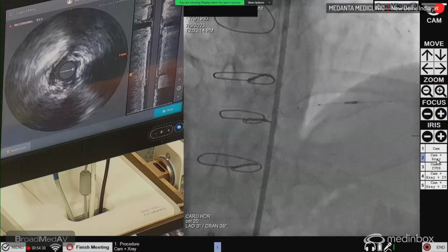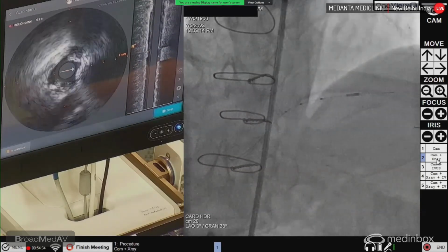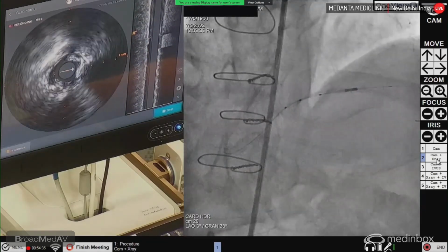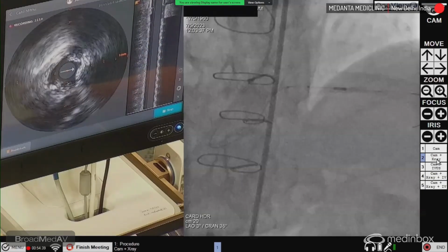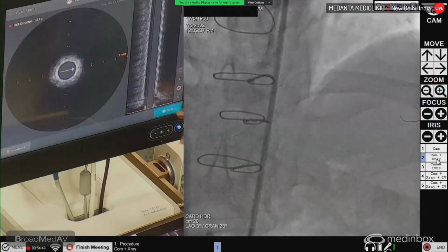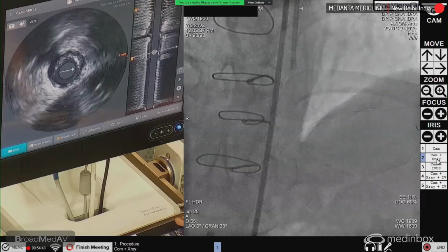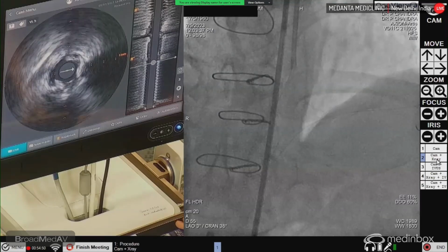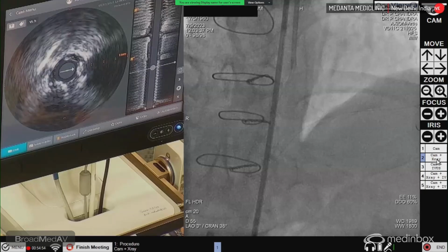I'm going gradually inside, and we can do a check shoot to see how long the stent has to be. So this is a good measure. You can see there is 32, so we have to take 36. A 38. Okay, 38. 36. We have 40. A 36. 2.5 by 36. 36 might be a little short.